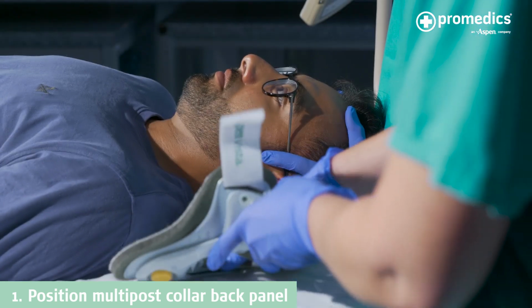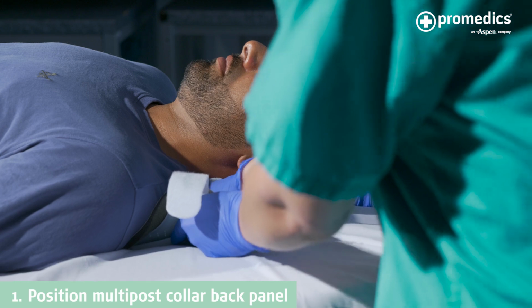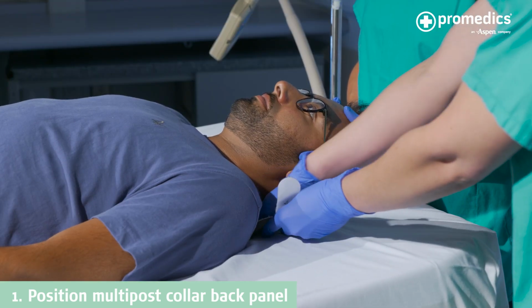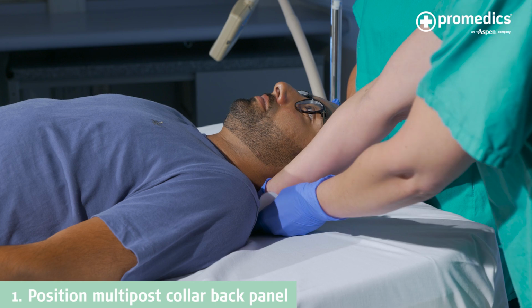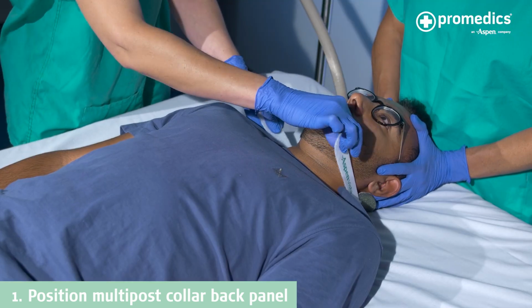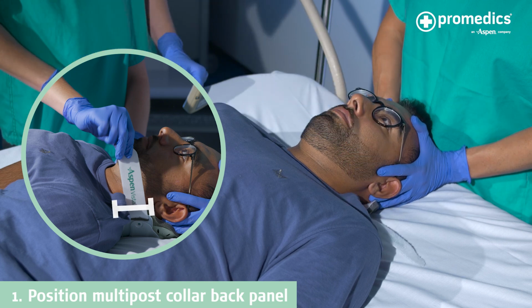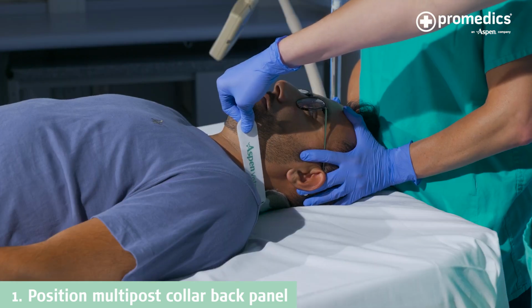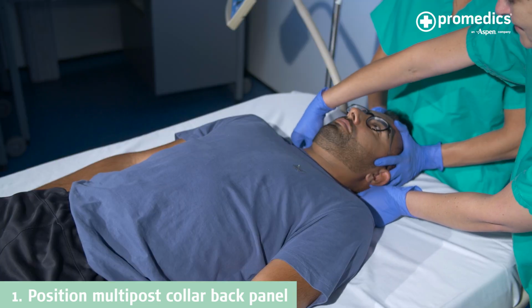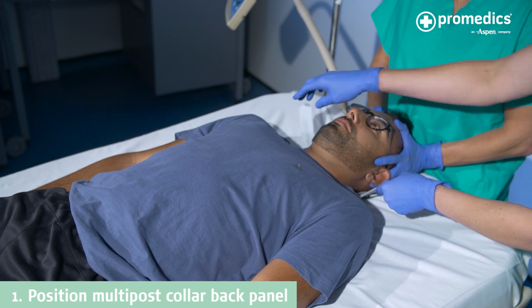Place your hand on the back panel and simultaneously press down to compress the bedding. Slide the back panel behind the patient's neck until it is positioned correctly. The back panel should be centered behind the patient's neck, and the Velcro strap should be pulled out to the sides and aligned at the midpoint between the patient's earlobe and the top of the trapezius muscle. The patient should be encouraged not to move their head and to lie still.